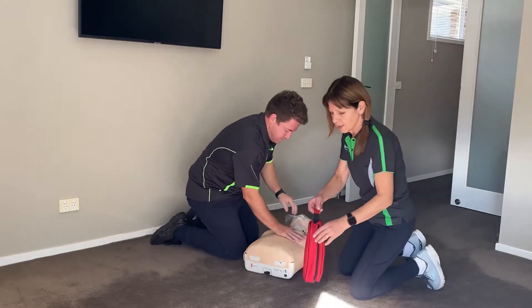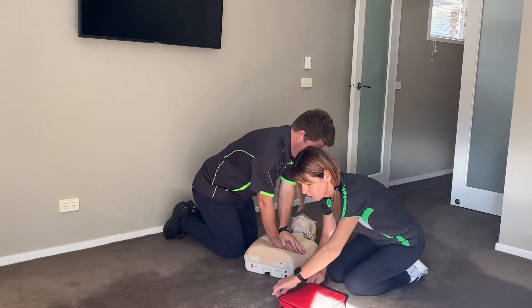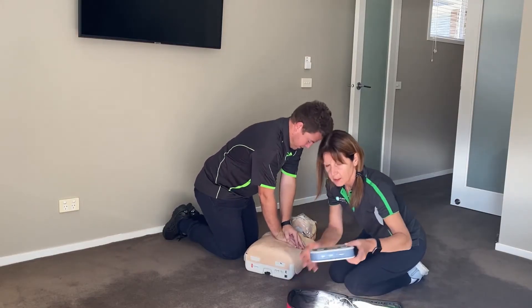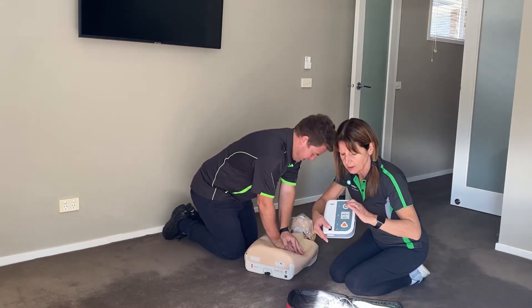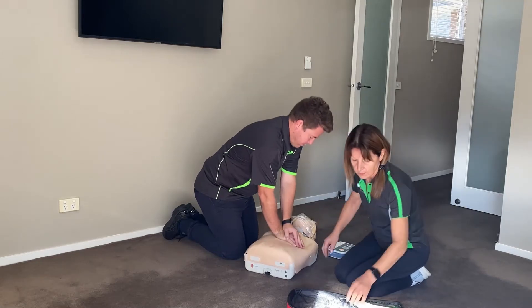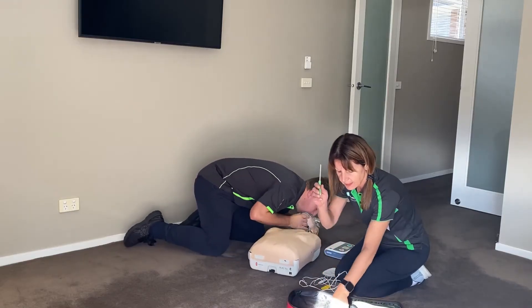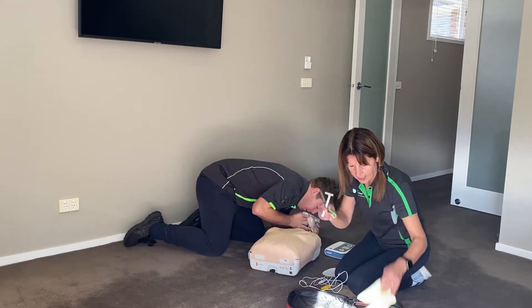When I arrive with the defib machine, I will remove all the contents I require. Switch it on. You will need pads, scissors, shaver, and towel.